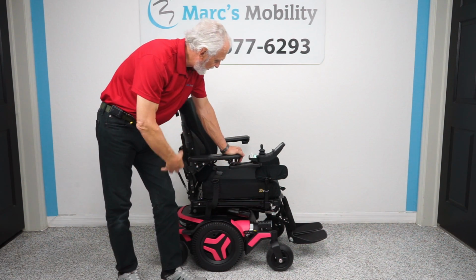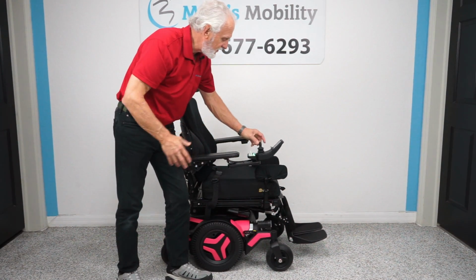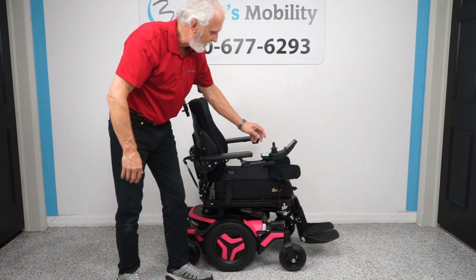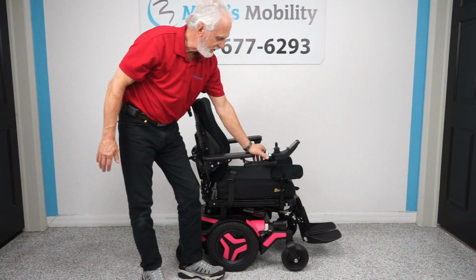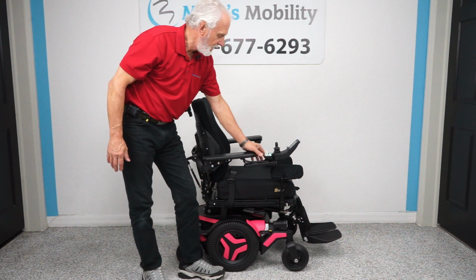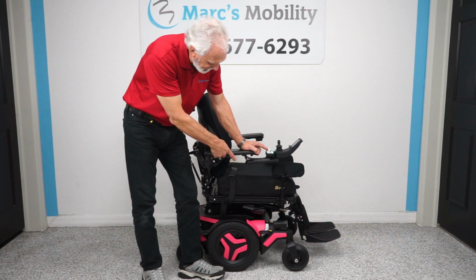So before I show the rest of the chair, which is an amazing chair, let me show you how to make the seat move up and down, back and forth. You can do everything through the joystick, but I'm going to use this little switch box because it's quicker for me. The first button is the seat lift. If you push it forward, you'll start seeing the seat going up.